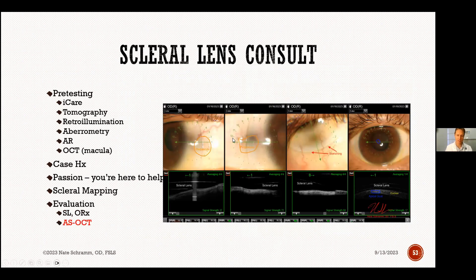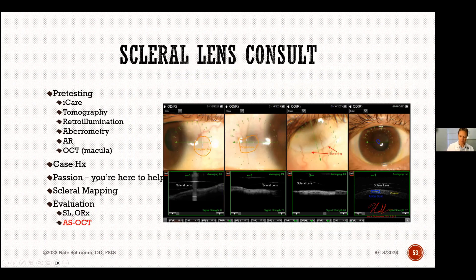For newer practitioners: this image shows blanching on the lower portion of the scleral landing zone. We also do anterior segment OCT — the scleral lens is visible, and beyond the dotted line is the limbus and sclera. I don't usually do anterior segment OCT on a first-time eval unless I see something tricky. In this case I did it to show the lab the amount of blanching, and I usually have the virtual assistant send all four scans and a photo of my fitting notes to the lab.